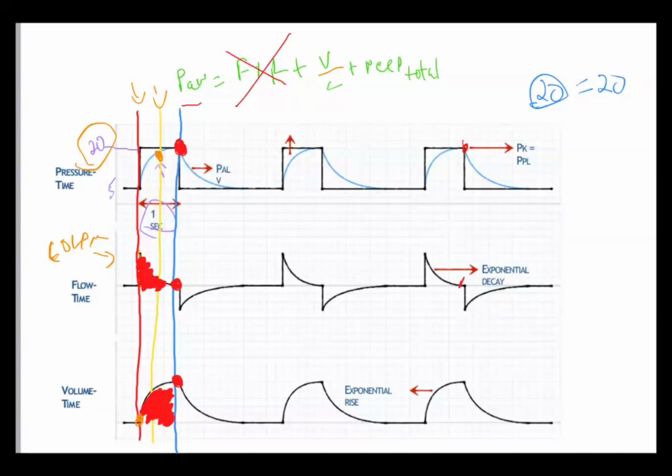In the following videos, what we'll do is start to manipulate the equation of motion and go through what each difference would look like, meaning if there's increased compliance or excessive or vigorous inspiration by the patient. Because in those situations, you will not know the alveolar pressure. And while it might not be high, you still don't know what it is. So in theory, it could be anything, which gives me pause when I have someone on pressure control.